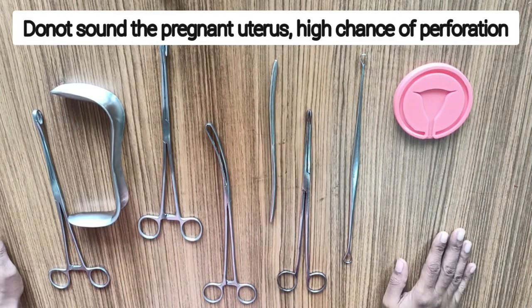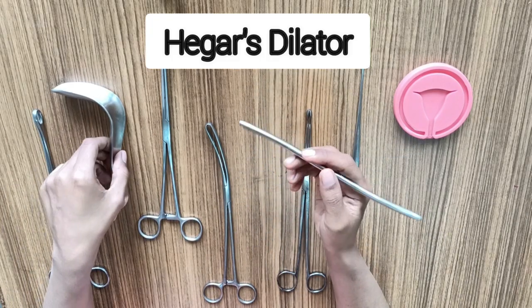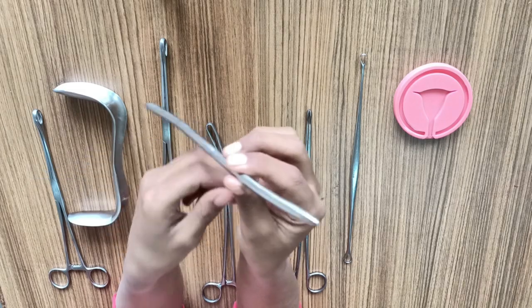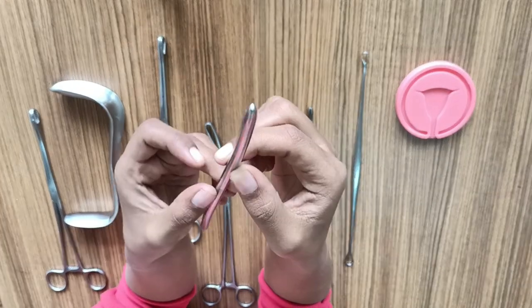Use the uterine sound only in gynae procedures, as in obstetric cases there are high chances of perforation. Moving on, to perform the dilatation of the cervix, we require a Hegar's double-sided dilator. It is a metallic rod that is round and slightly curved with a conical tip, and it has two ends with different sizes.